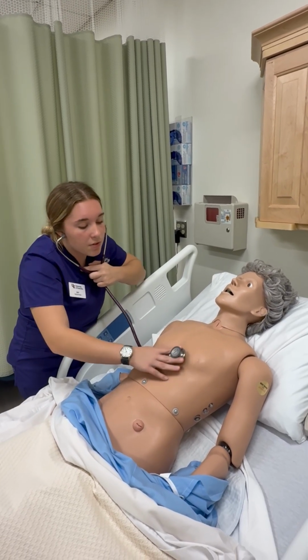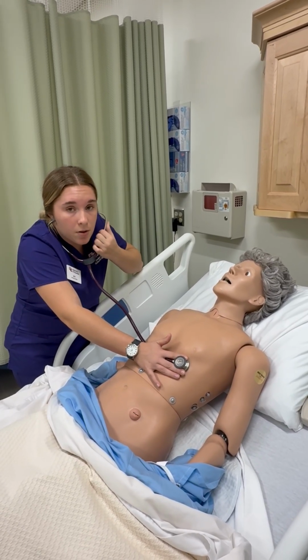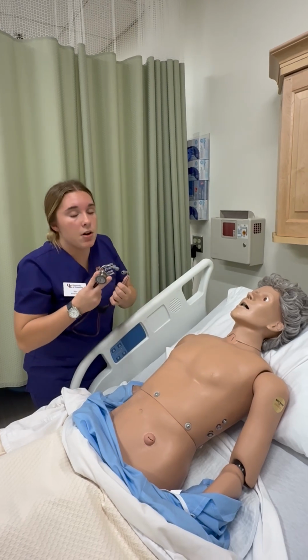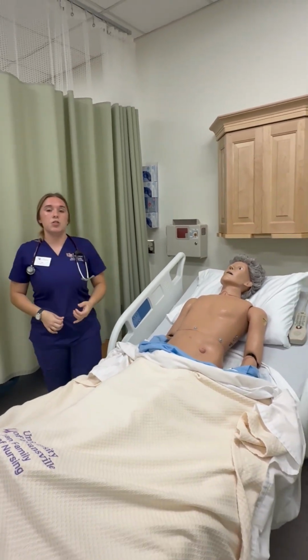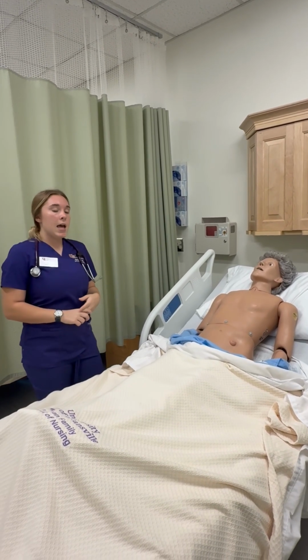After this, I'll move down to the fifth intercostal space, move over to the midclavicular line. Here, I'll be listening to the mitral valve, which is also known as the apical pulse, and I'll be listening to this for a full minute. After listening to this for a full minute, I would note that I heard both S1 and S2, S1 being a low pitch and S2 being a high pitch. I would note that it was around 70 beats per minute, which is an expected finding.